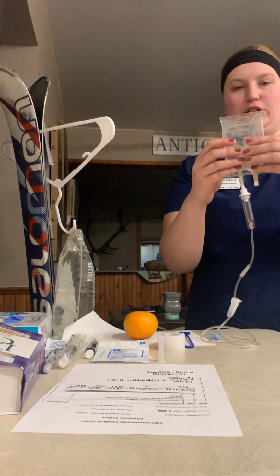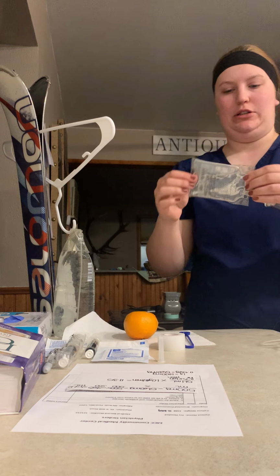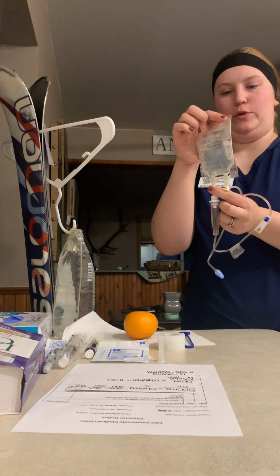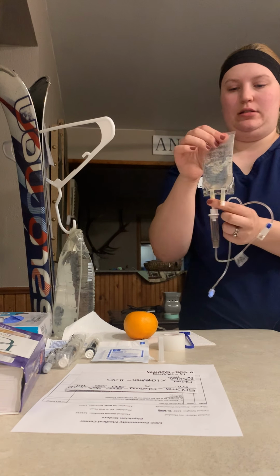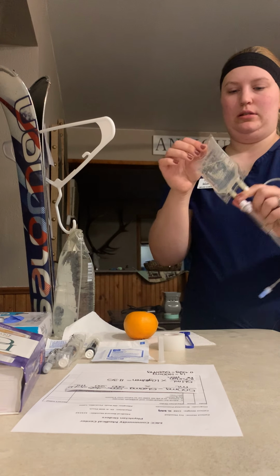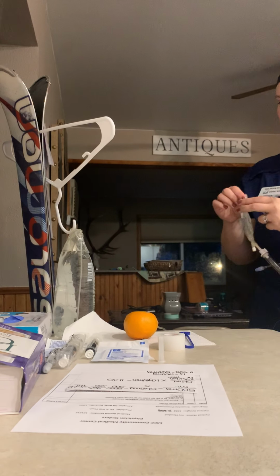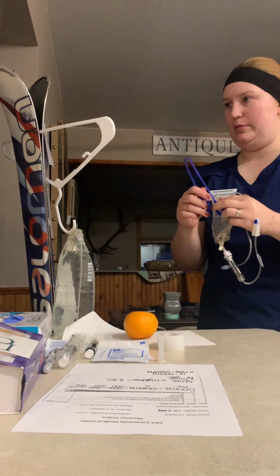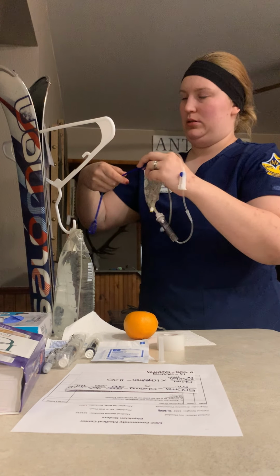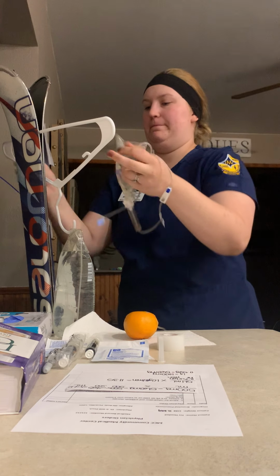So now that you got your medication in there, just make sure you're turning it. You don't want to shake it vigorously, just turn it back and forth a few times. Make sure it gets all mixed up. Okay, and then mine is already pretty low.